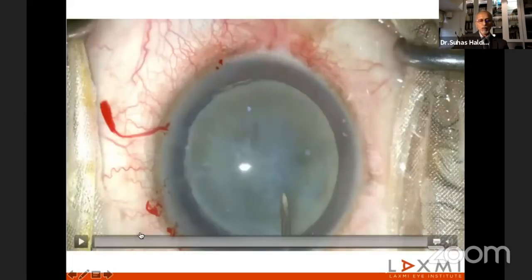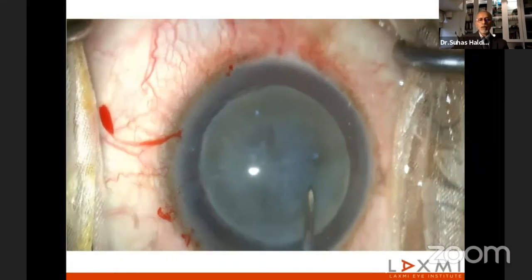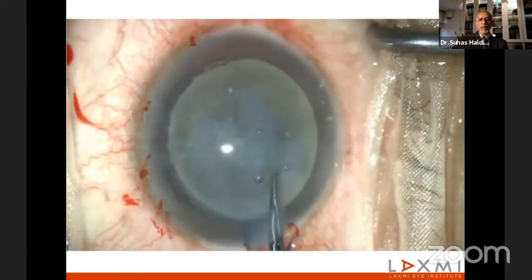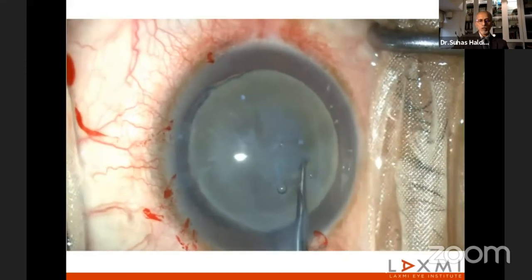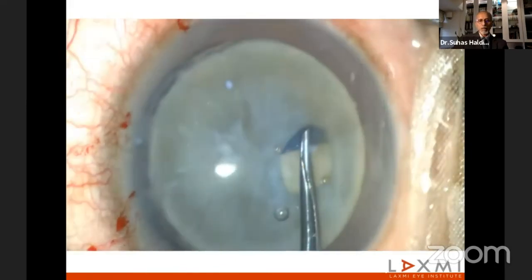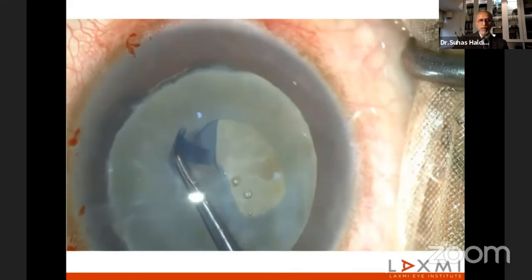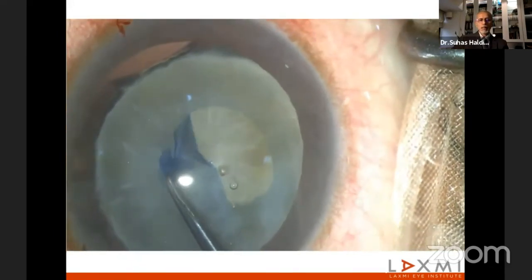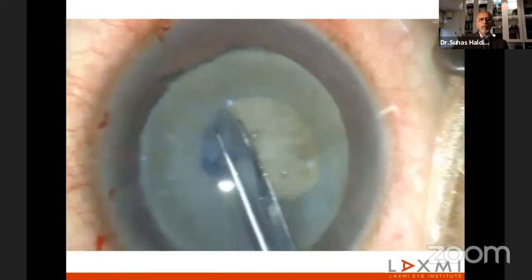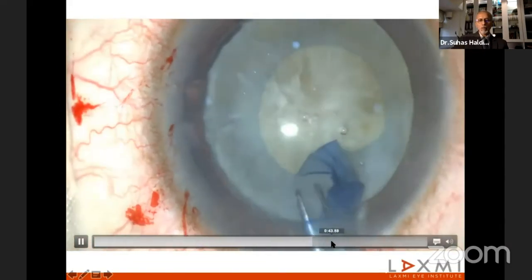Now let's look at this. This is an extremely loose bag. Less than 25% of the zonules are supporting the bag. The eye is filled with good quality dispersive viscoelastic, like Viscoat. And I very, very carefully continue with the rhexis. At any stage, if I feel that I can go no more, then I would stop, put a couple of hooks and continue with the rhexis. But fortunately, it is possible here.